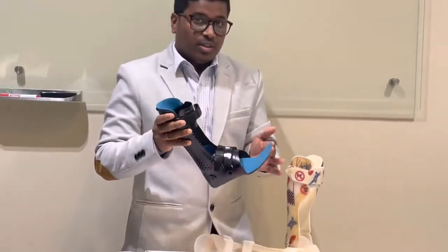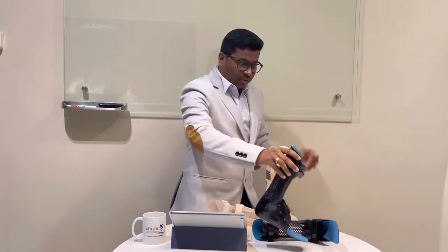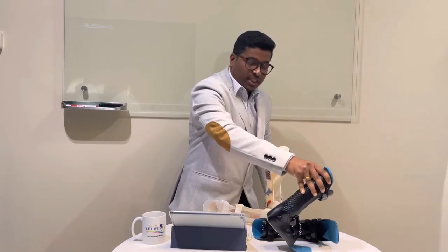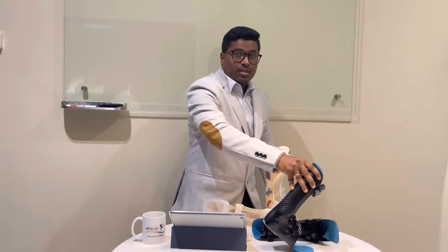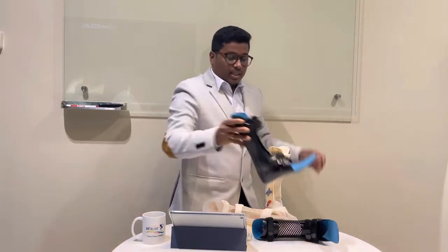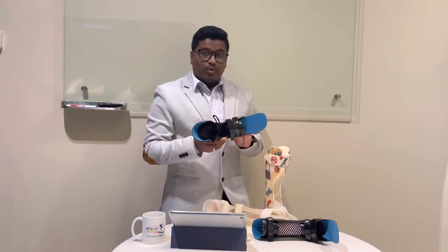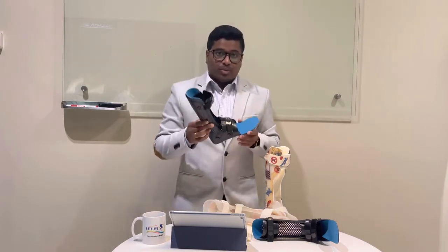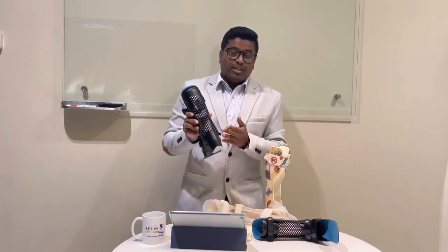Now I'm going to show you the function of the foot section. This is a custom-made AFO — you can see that the patient feels more comfortable during walking because of this flexibility. This flexibility is custom-made according to the patient's need, body weight, and muscle tightness. The AFO is made using 3D printing, starting with a 3D scan of the patient's foot.